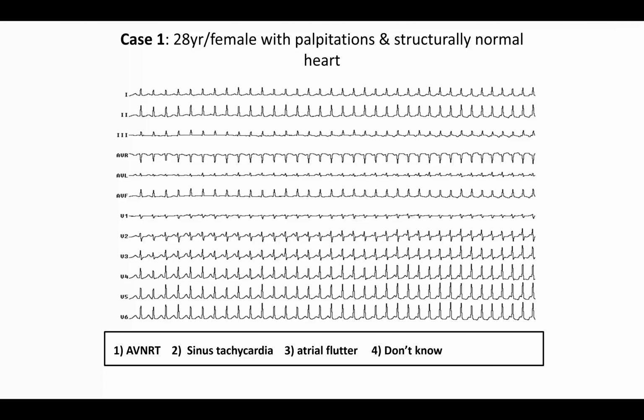I think I should have included some brady studies, because clinically the number of brady studies we do is less compared to the tachy studies. The commonest is if we are confused whether it's an AH block or HV block, nodal or not. I'll not talk about SNRT, because SNRT we need to discuss in detail. But more simply, it is when you want to see whether it's an AH block or HV block in the lab.